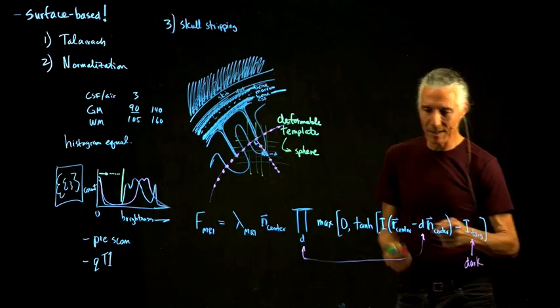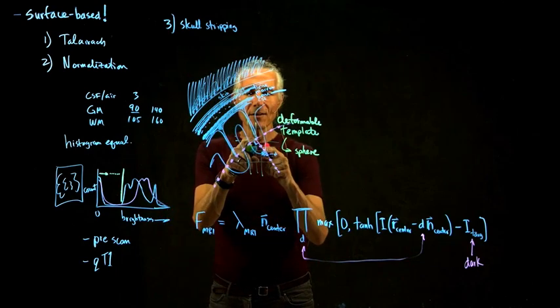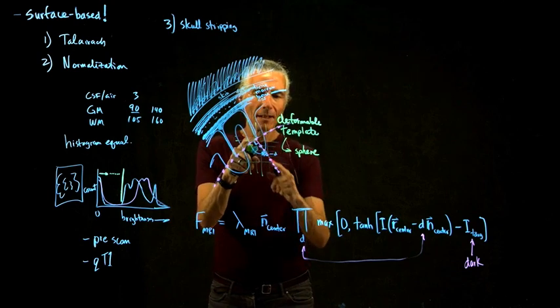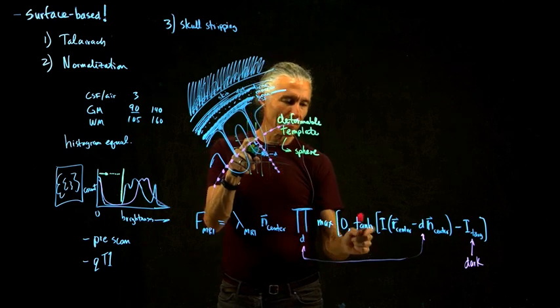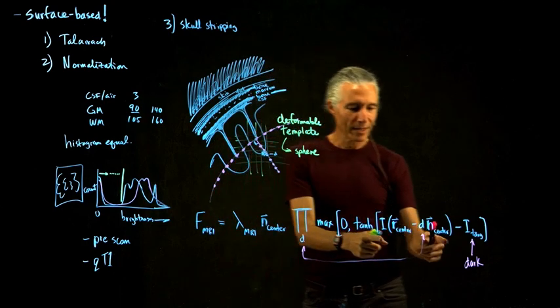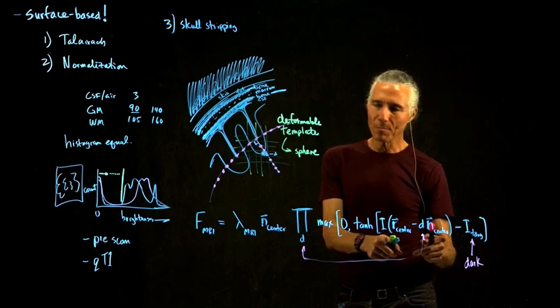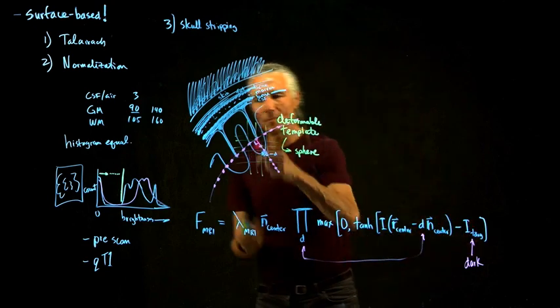So basically the way this equation works is, for each time step, you move perpendicularly down away from the surface, looking for a bunch of sample points. You basically multiply them all by each other, maybe squash them a little bit, forget about that, but basically the sample point is the brightness of the current pixel, and then I subtract off my target. And if the pixel is brighter, like we're still inside the brain, then this is going to be a positive number, and that's going to push me out.